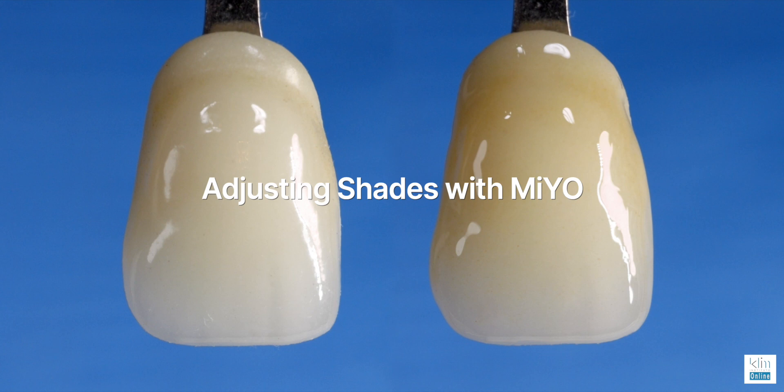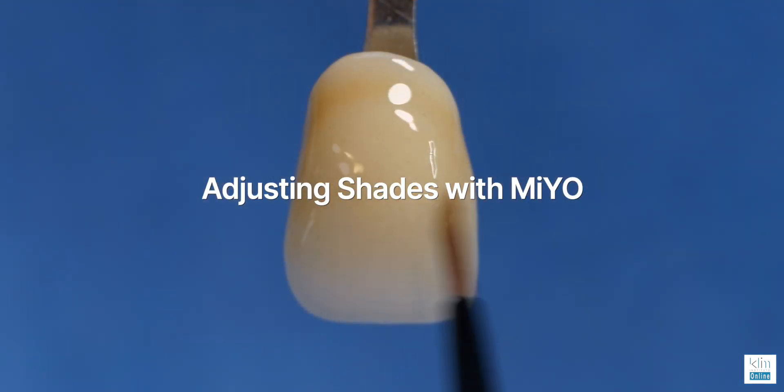James Clem here. This video is going to be a lot of fun. It's about understanding Vita shades, particularly if you have a restoration that you need to add more chroma or bring the value down. You can also take the value up, but that's for another video. Here we're going to work in the A zone.